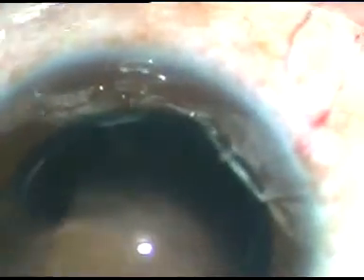Now the cortical lens matter is being removed. A 23 gauge Simcoe cannula is being used. A little bit of cortex is still there at around 12:30 o'clock. I could remove it through the main incision itself.